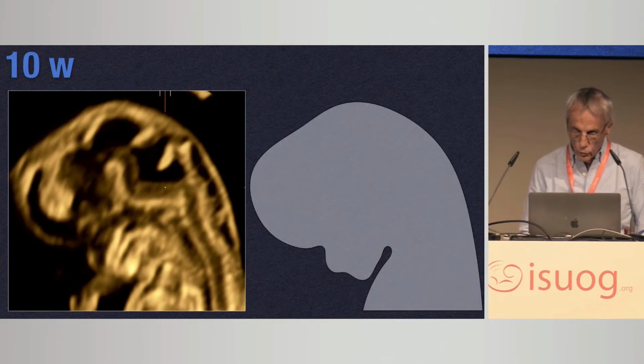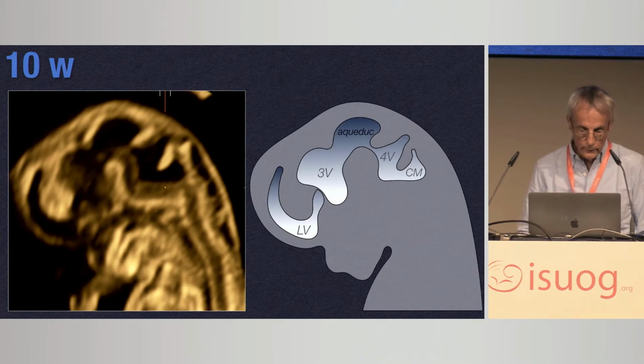First, you can see all the liquid part. This is the lateral ventricle, and that means we are not exactly on the sagittal, but it's really difficult because it's small. We are not mid-sagittal. This is the third ventricle.